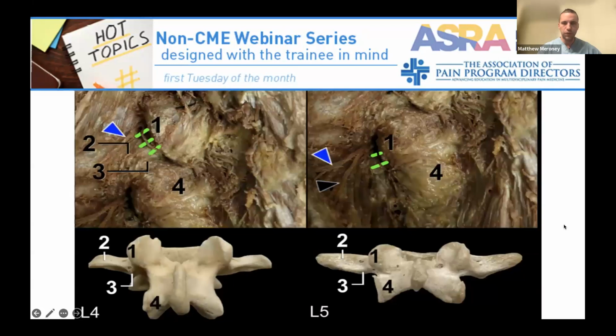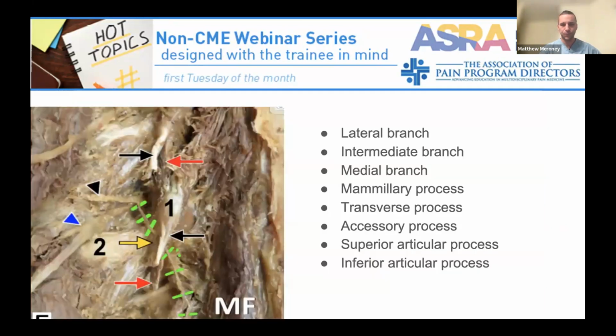Just from an anatomy standpoint, if you look down here, you can see obviously the lamina, transverse process, pedicle. And this strip right here is going to be the target for me. You can see the transverse process, and another example here. Once you start getting more intimate with this anatomy, you'll realize that transverse processes can really vary in size and shape. They're not flat platforms like you might guess. Getting familiar with that is a little learning curve, but I wouldn't say it's super scary.